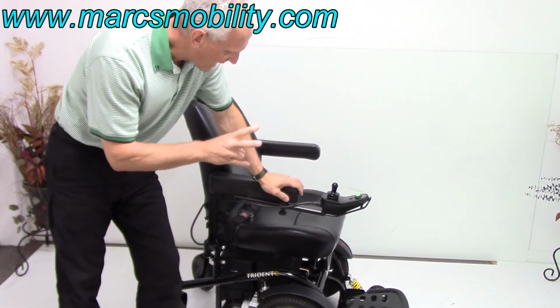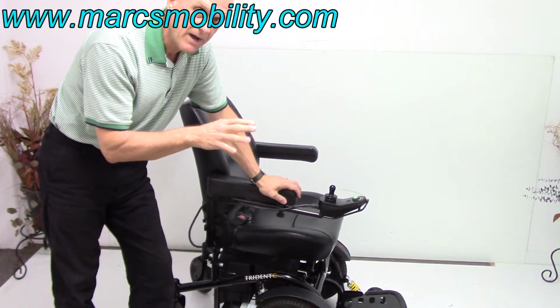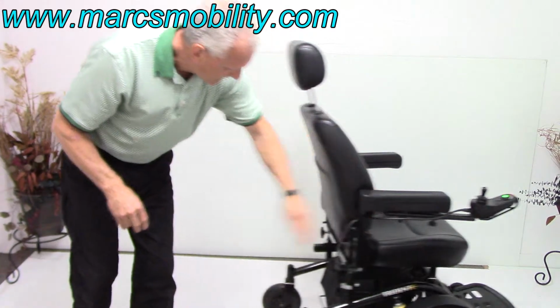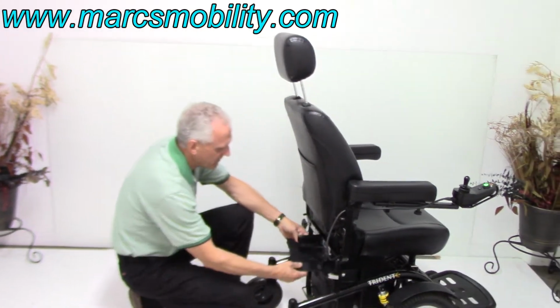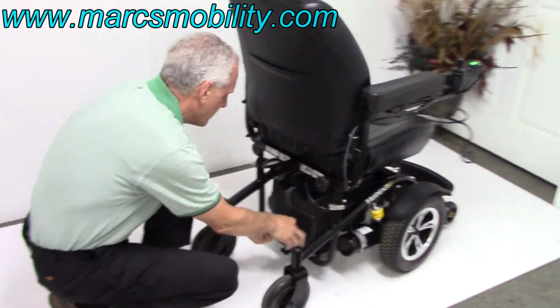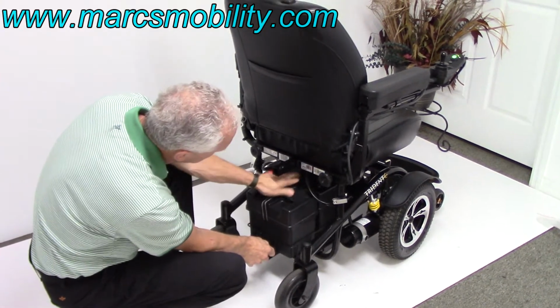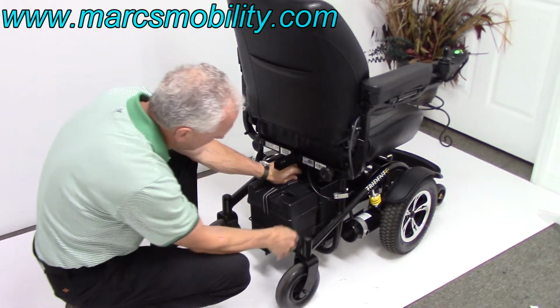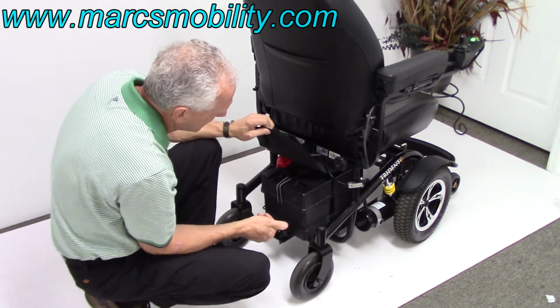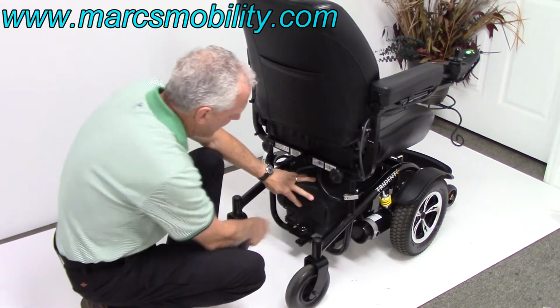And as I said, it takes 2 batteries with this chair, and they're 35 amp batteries, so that'll give you about 15 miles on the battery charge. There's 2 35 amp batteries, and they're in the boxes back here. There's a box back here, and if you pull the pin right here, then you can pull the batteries out. There's 2 battery cases, one here, one there, back to back. So if you had to change the batteries, you would take these battery cases out and replace the batteries. Push it back in, and the batteries are locked back in.